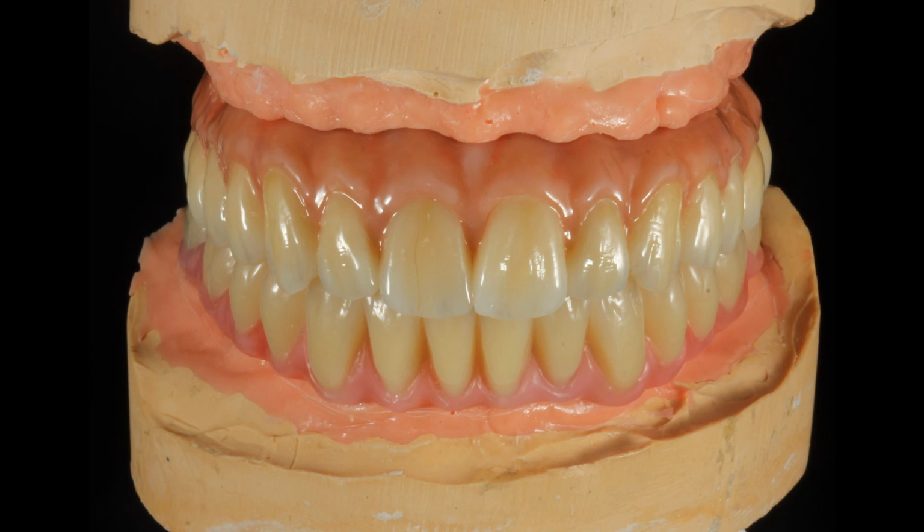So in grinders, I like to still do titanium wrapped in acrylic for the lower arch. That way, it's not like glass against glass. With zirconium upper and titanium acrylic lower, the lower will always be softer and kinder to the upper zirconium.